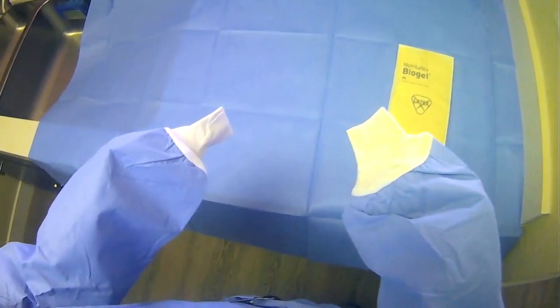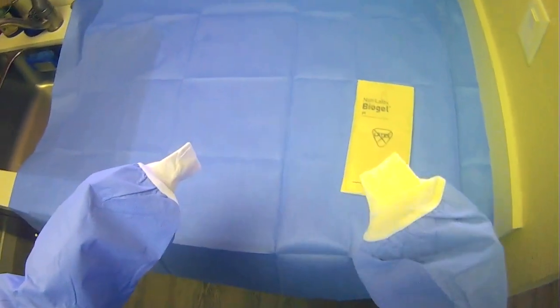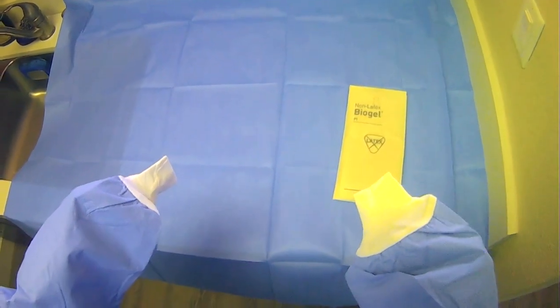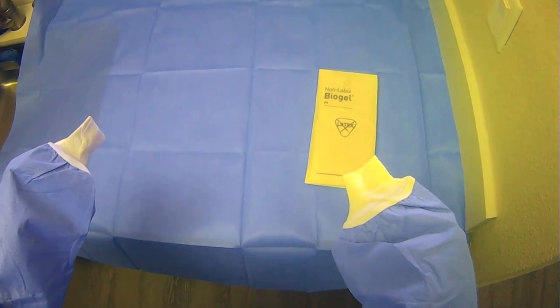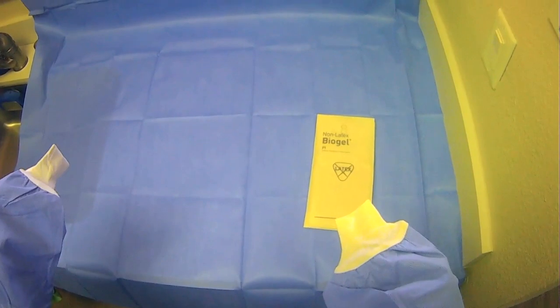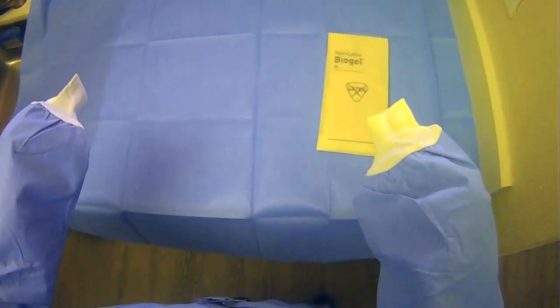Now everything is sterile on this side, and there is a strap, I'll show you a little bit later, so hopefully you'll have some assistance to strap you in. There's a strap around your neck and around your waist that someone else will help you get strapped in. There are also techniques for you to do it on your own. However, most junior trainees generally don't do this because it makes other people uncomfortable, because the techniques require some skill to avoid contaminating yourself.